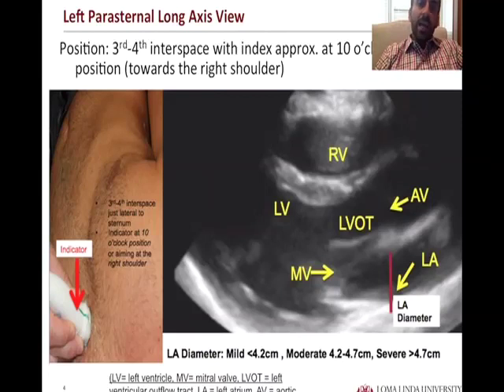So a good marker for overall cardiac status is the diameter of the left atrium, meaning that if the left atrium is not dilated, one can often appreciate that the heart should be without severe abnormalities. However, if the left atrium is dilated, that is definitely a warning sign that you can expect potential cardiac abnormalities to exist. And you can see the measurements here as reference.